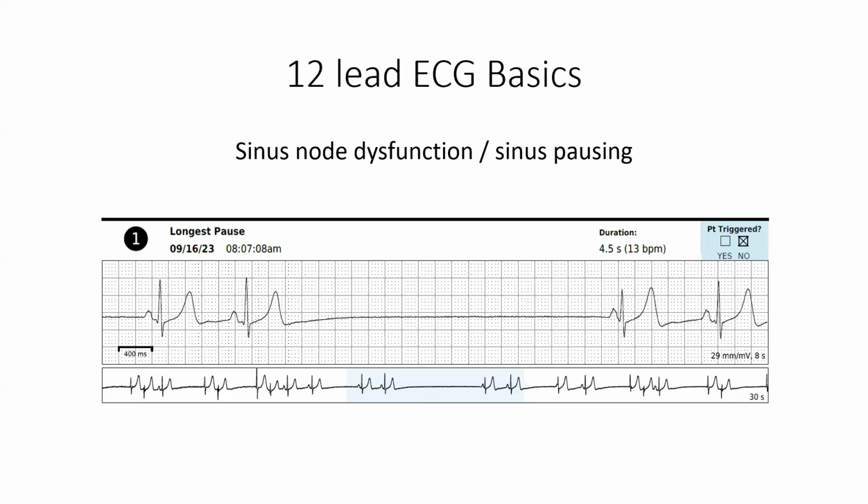Initially, someone talked with her about needing a pacemaker, but being 51 years old and needing a permanent device placement is not without its long-term perils. So what we ended up doing was ablating her SVT, and it actually reduced the number of sinus pauses that she was having. It hasn't gotten rid of them completely, but they're definitely better. And as you can see here, she had a significant pause.